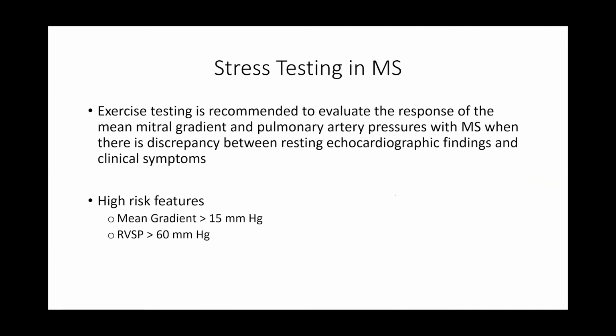Then stress testing in mitral stenosis is very, very important. Whenever there's a discrepancy between resting echo findings and the clinical symptoms, you need to think about doing stress testing. We had one patient a few months ago, a young female patient, who came with, I don't remember what the indication for the TTE was.